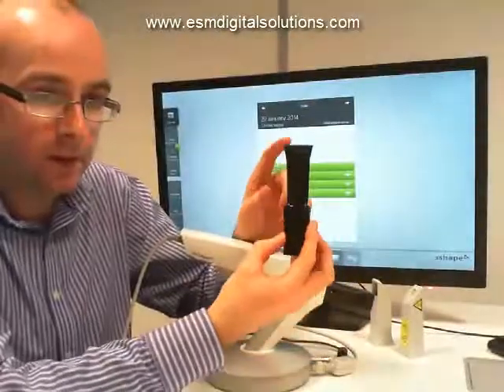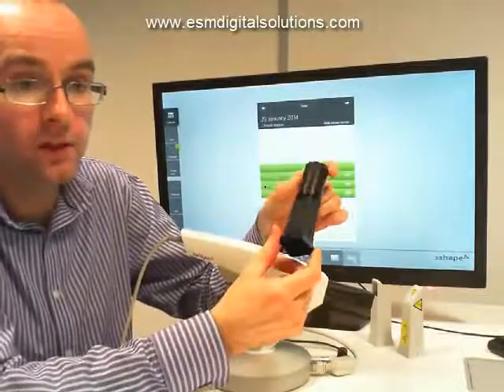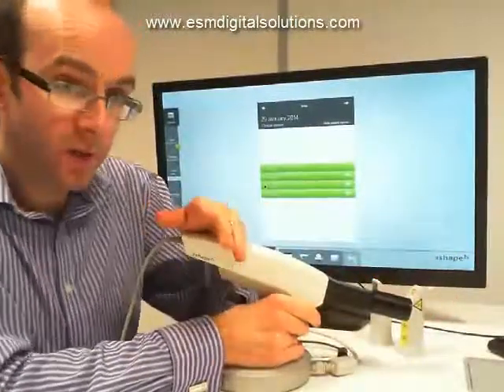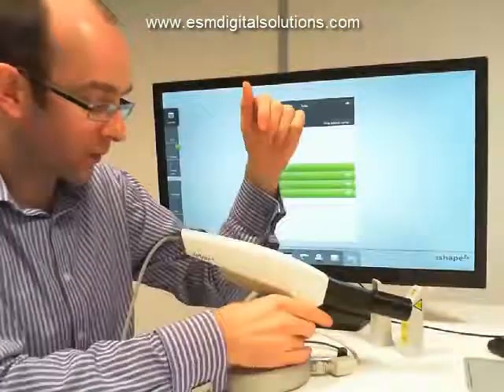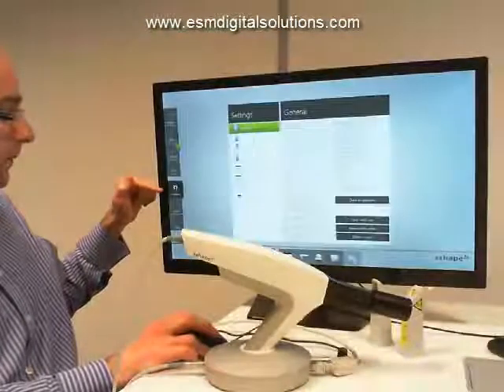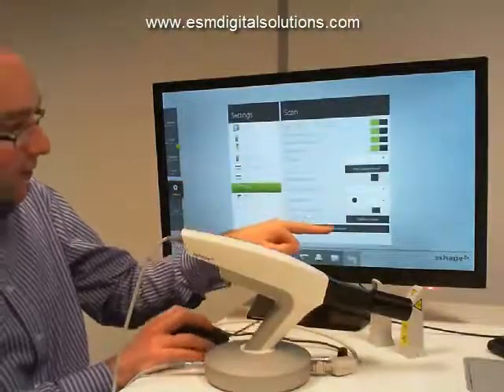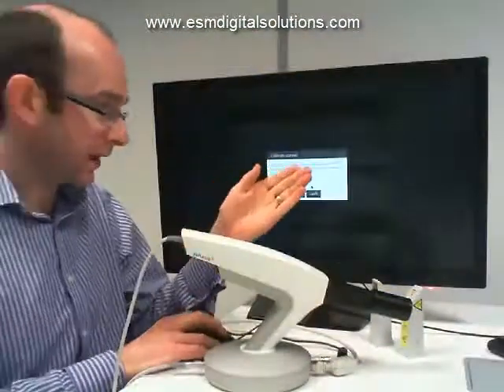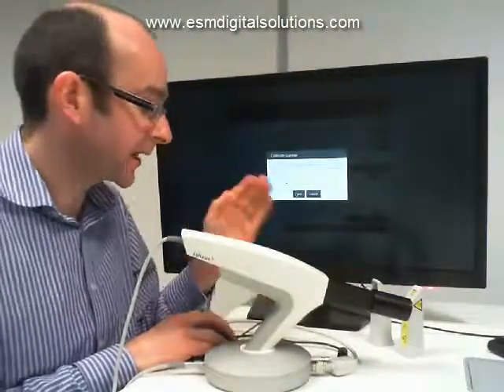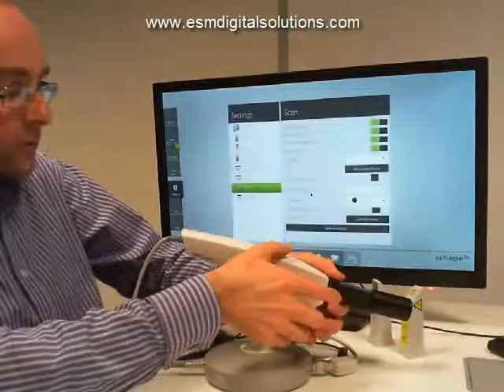The third tip is the calibration tip, and its job is to make sure the scanner is working the way it should. During a calibration process, we tell the software we're going to calibrate. We go to the configure option on the main screen, click configure, then click on scan, and then we have the option to calibrate scanner. When we click calibrate scanner, we're given the message: please mount the calibration tip on the scanner and press next, making sure the tip is free of hair and dust inside. Then we click next and the scanner goes through a calibration process.